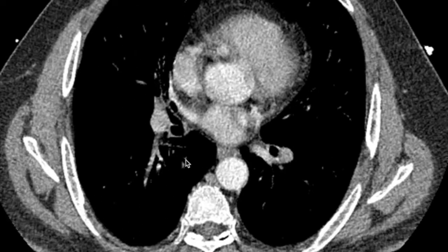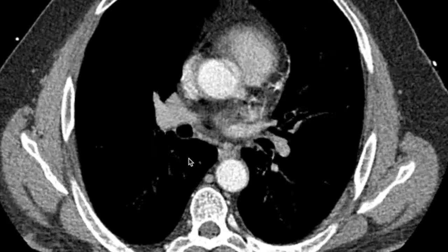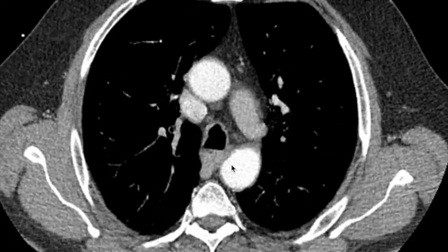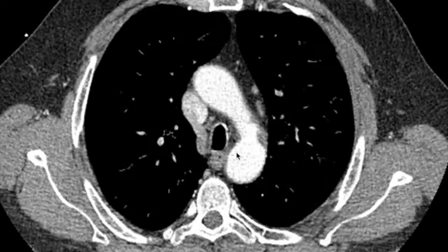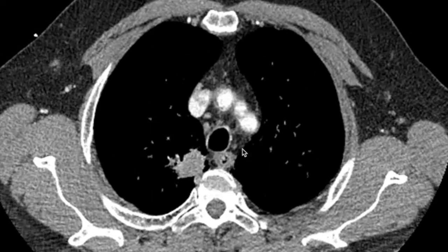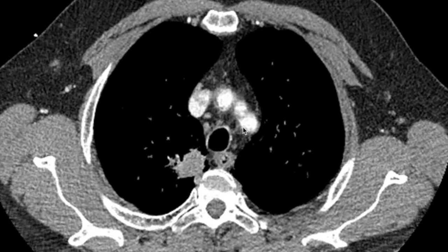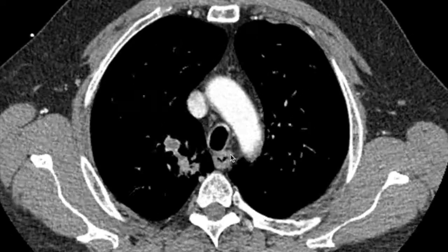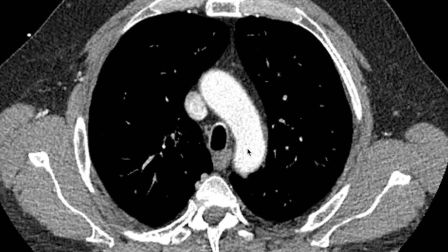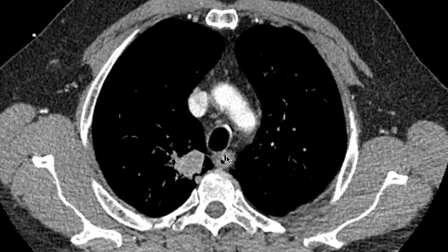From the descending aorta I'm going to follow the aorta proximally as we come up the chest, all the way until I get to the level of that lung lesion. The level where it's likely to get apposition to the esophagus is above the arch. So using the ultrasound and the aorta as a landmark, I'll follow it up until I get to the arch, then rotate at that level around to the right — and on the right side of the esophagus is where I expect to see that lung lesion.